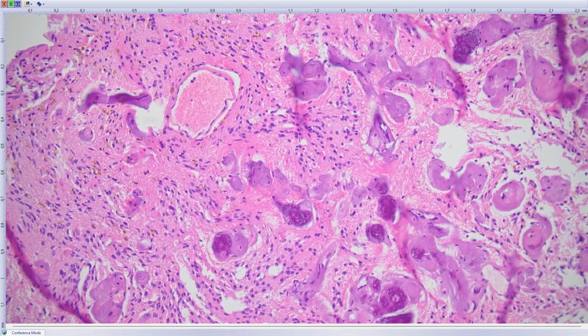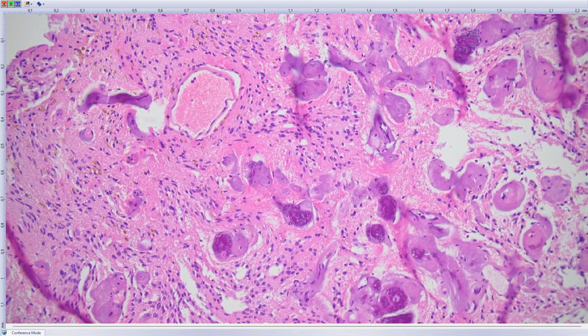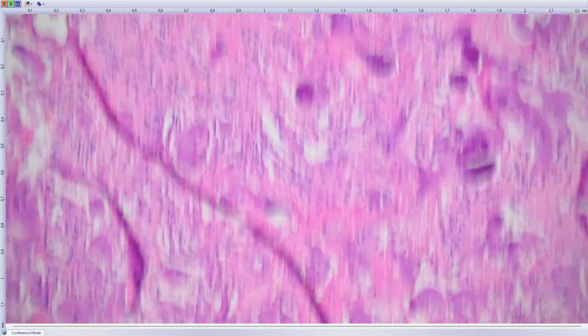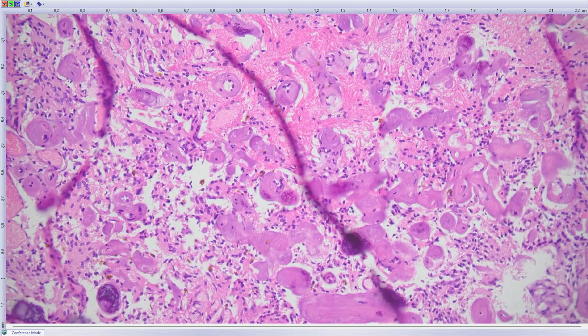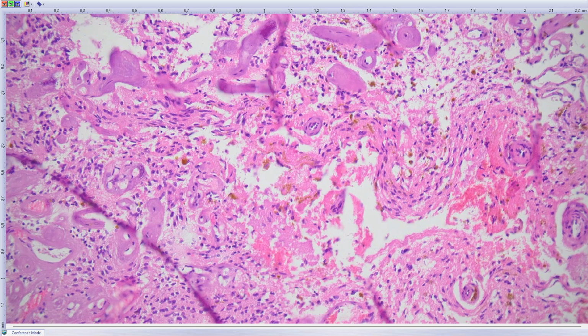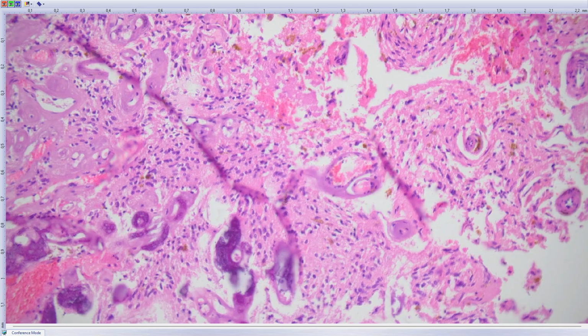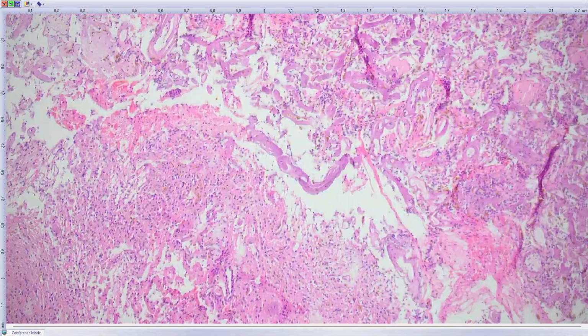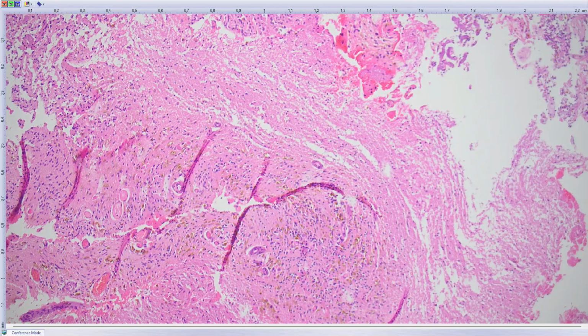And the tumor cells by themselves are, again, roundish, not that big atypia, not very much mitotic activity, no necrosis, no true microvascular proliferation. And just based on this morphology, some hemosiderin was present there.